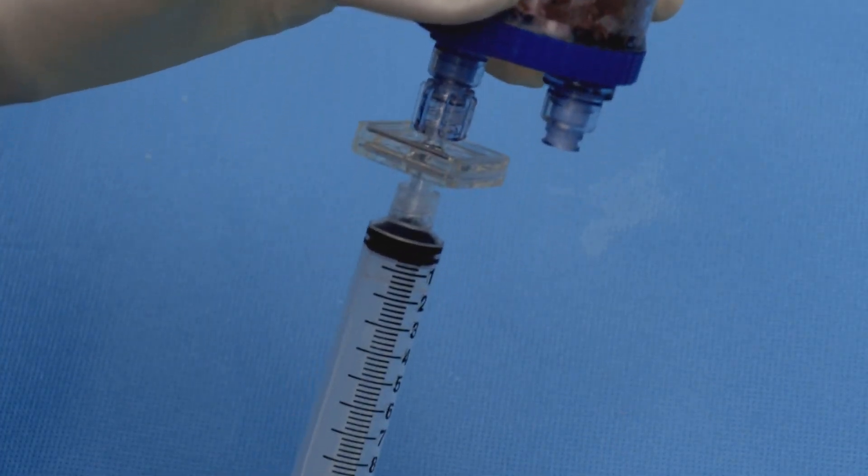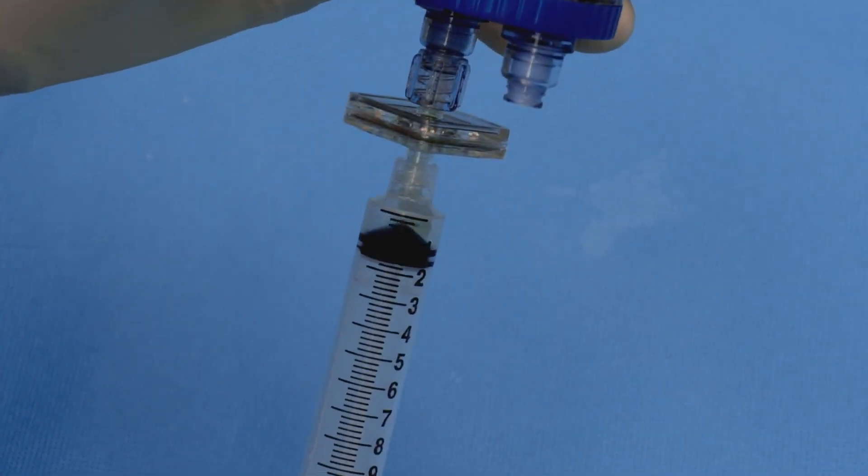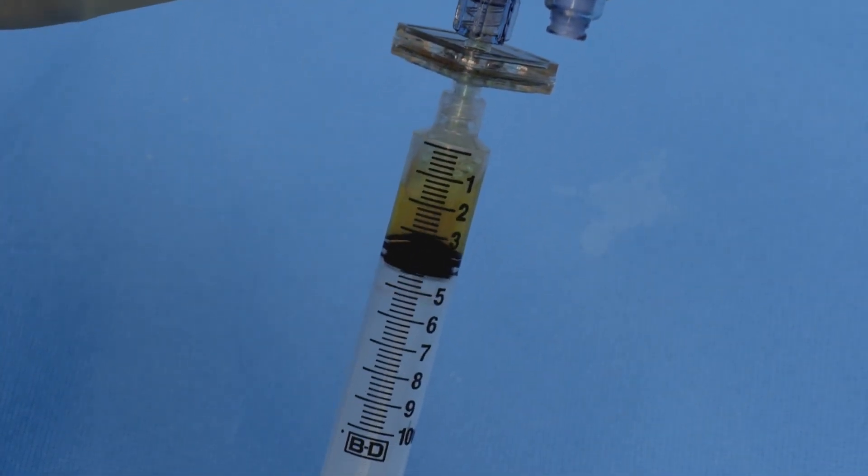Turn around the thrombinator and withdraw 10 ml of autologous thrombin.